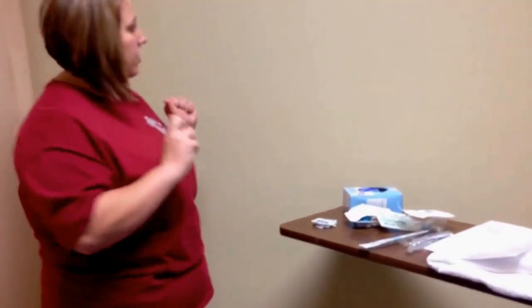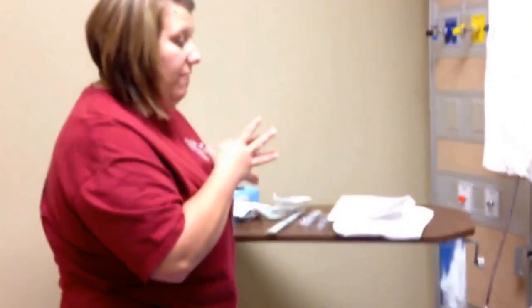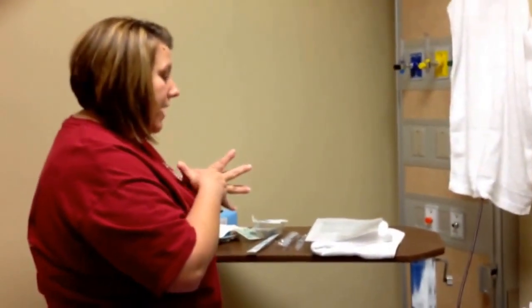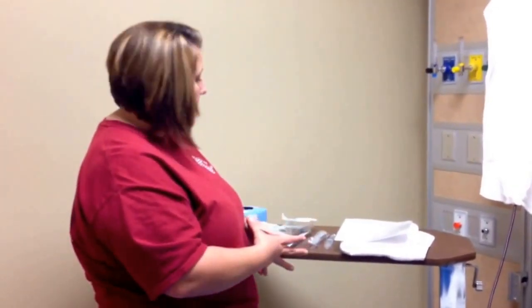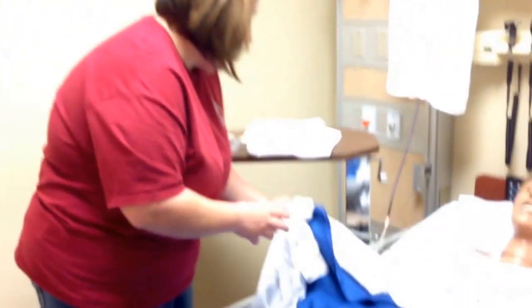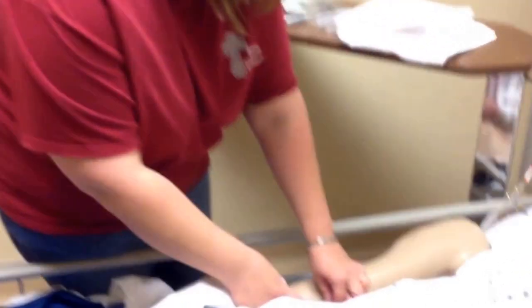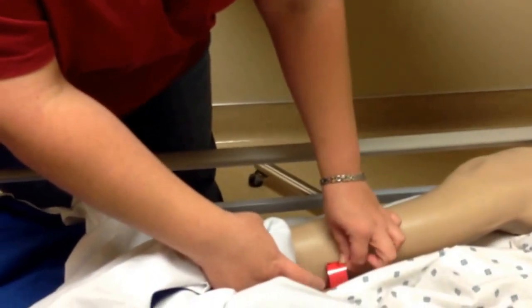I'm going to enter the room. Hello, my name is Tara, I'm going to be your nurse today. The doctor has ordered an IV placement today just so we can give you medications if you need them. Have you ever had one before? She tells me she has. The first thing I need to do is verify your identity — can you state your name for me? He says he's Mr. Joe Dunn. Can you tell me your date of birth? He says 5/2/50. I compare this and verify the ID number.